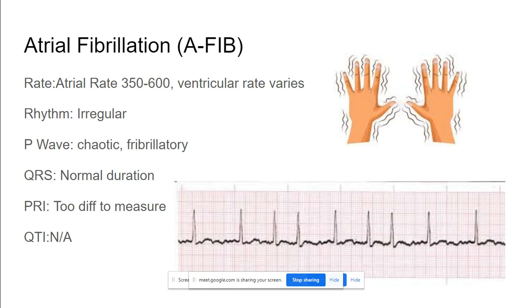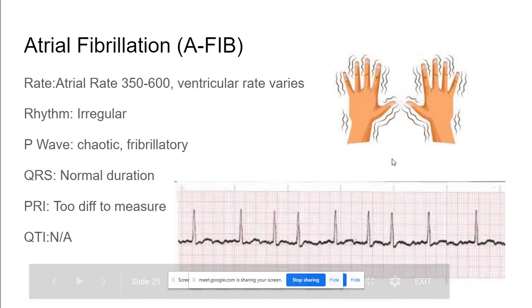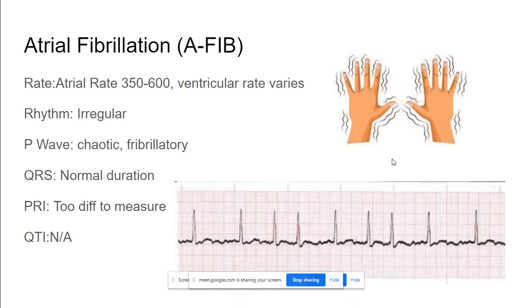So you would let the nurse know, you would take it to them and say, it looks like we've got AFib here. And they'll probably be like, yep, that's why they came in. They're doing a pre-op EKG so that they can have a pacemaker placed or whatever. If it's something brand new, then of course they're going to treat it a little bit more seriously at that point. But it is a fixable rhythm once it's identified.